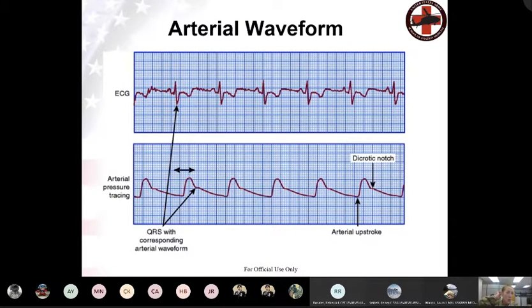And then Sergeant Yanez, when we talk about the EKG, what portion of the EKG represents the electrical activity that should stimulate a ventricular contraction? I'm not too sure, ma'am, to be honest. Okay. So when we look at the EKG, a QRS complex is going to give us an idea about ventricular activity. As you look at this EKG, hopefully you can see my cursor, this QRS complex is the electrical stimulus that we would hopefully get a mechanical response from.